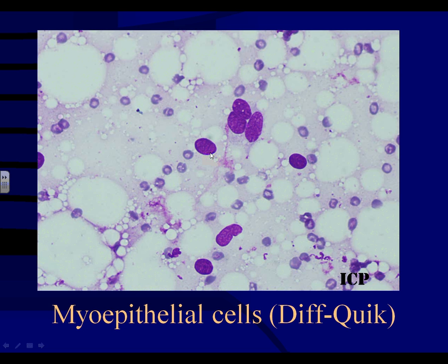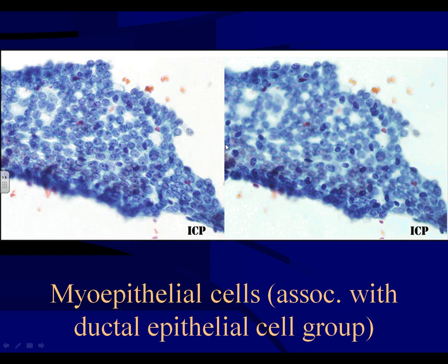Here's how myoepithelial cells sometimes appear: most of the time as single cells in the background, but you can also see them within or overlying the epithelial group by changing the plane of focus. In one plane you see all ductal epithelial cells, but looking more closely you can see the darker, more hyperchromatic, more oval football-shaped myoepithelial cells among them. The other cells with more open chromatin and slightly larger nuclei with nucleoli are your ductal epithelial cells.